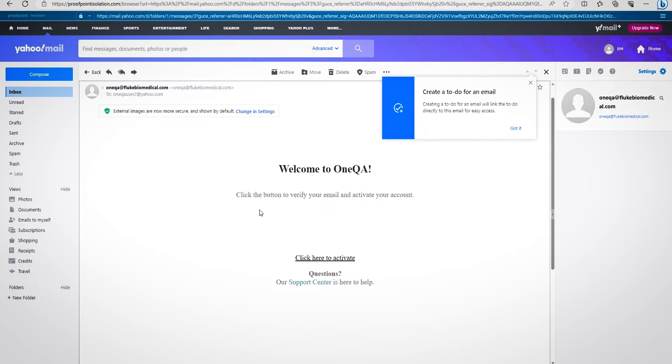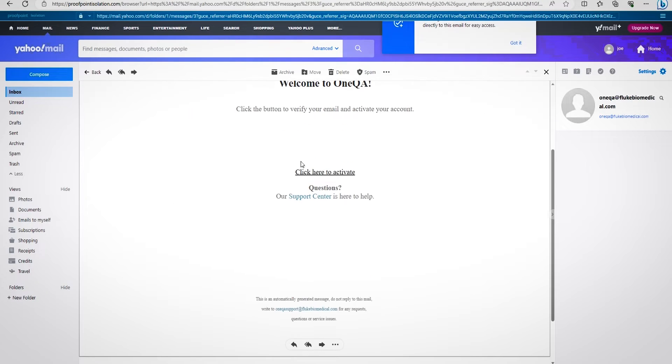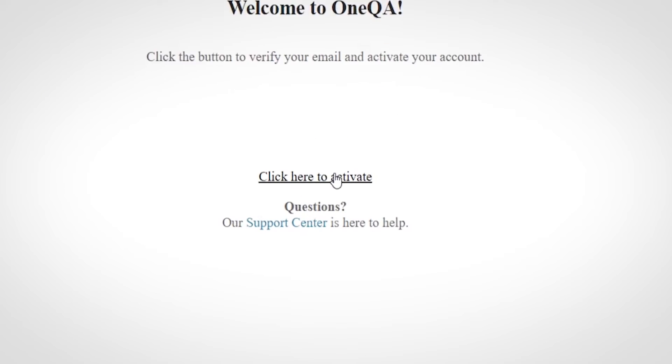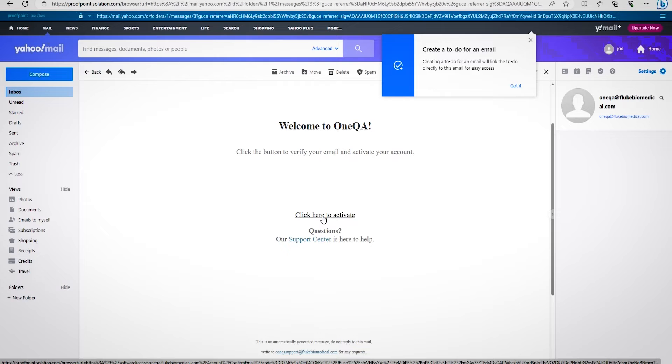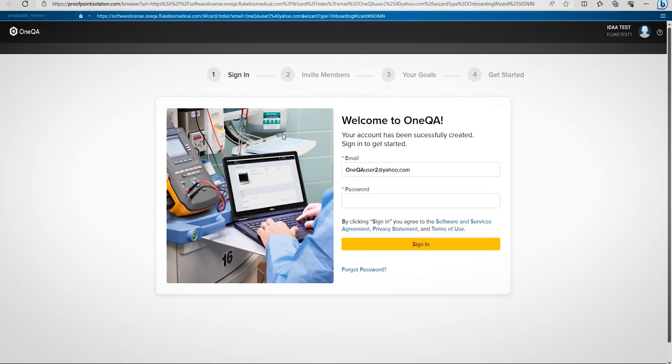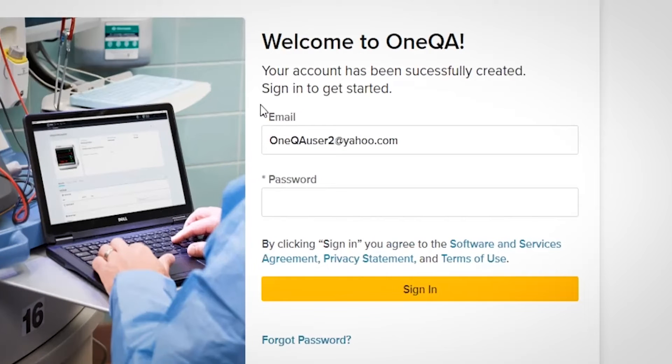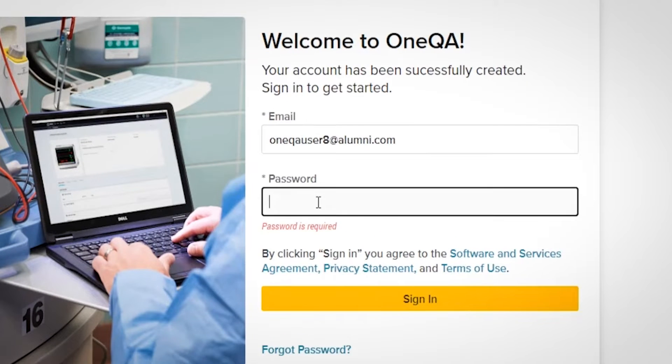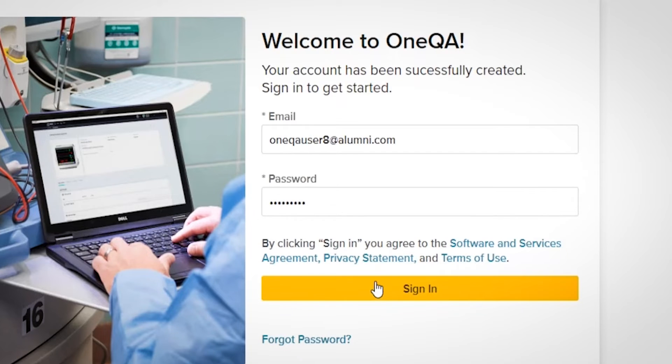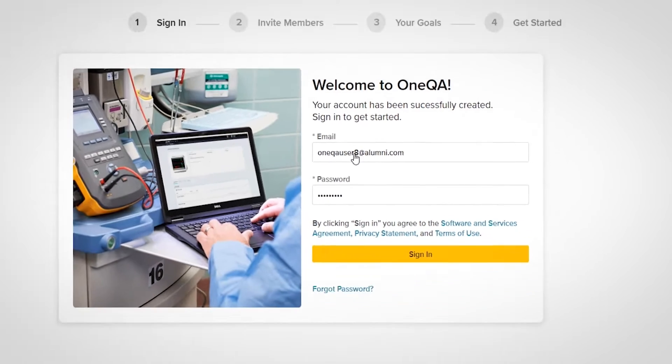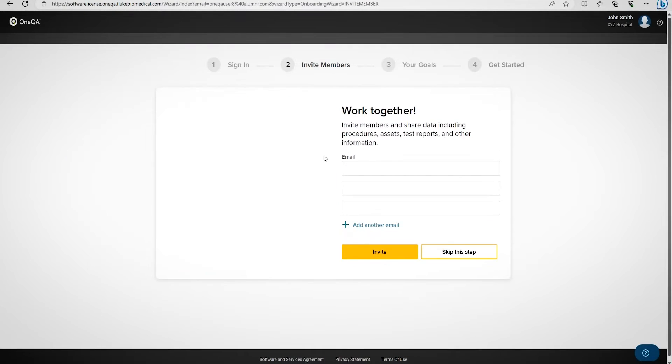When you receive the email, you will see a button that says click here to activate. Clicking this button will take us further into the account activation process. The first thing we'll encounter is a prompt asking us to sign in. Log in with your email address and password, then click Sign In.